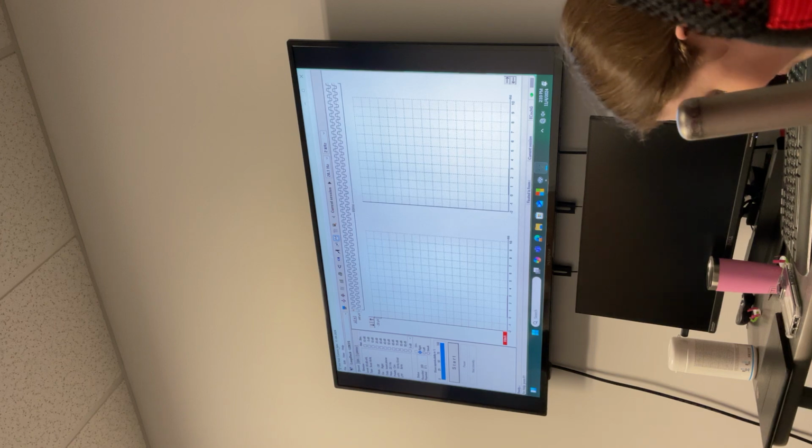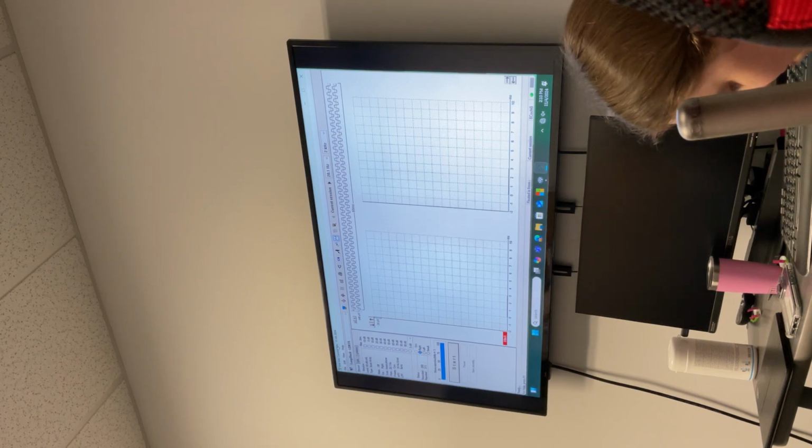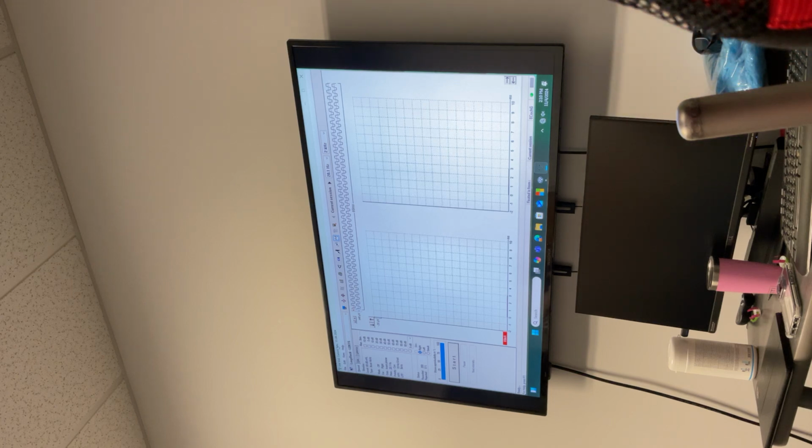So now you're getting familiar with the ABR for the lab 5 for the chirp. You start at 70, you decide what level you want to play. The end goal is to find the threshold. You can go 70 to 30, 70 to 20, 70 to 10, or 70 to 40, whatever level you want to pick. The goal is to find the threshold.